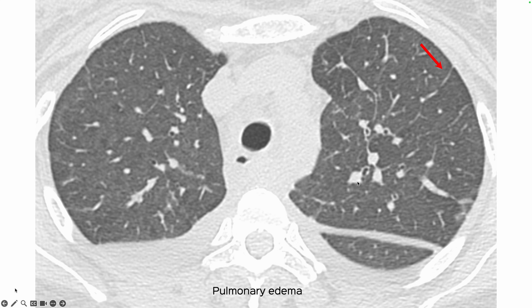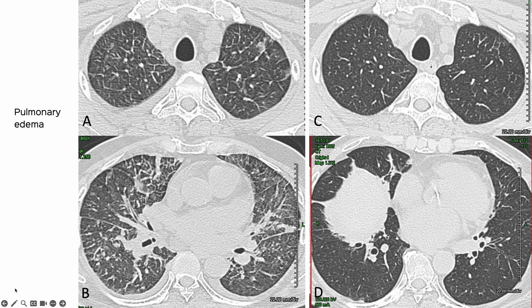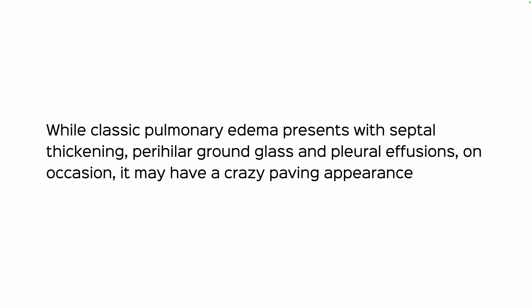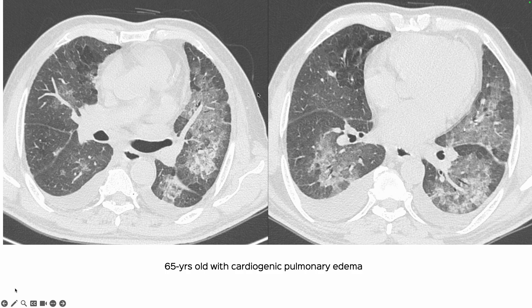Classic pulmonary edema presents with ground glass, pleural effusion, and septal thickening — as seen here with upper lobe septal thickening and perihilar ground glass. Diuretics were given and everything regressed within 36 hours. However, sometimes you can have a crazy paving appearance with cardiogenic pulmonary edema, as in this patient with multifocal crazy paving — though not as diffuse as alveolar proteinosis.